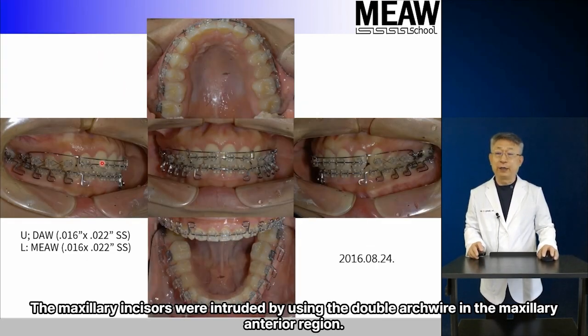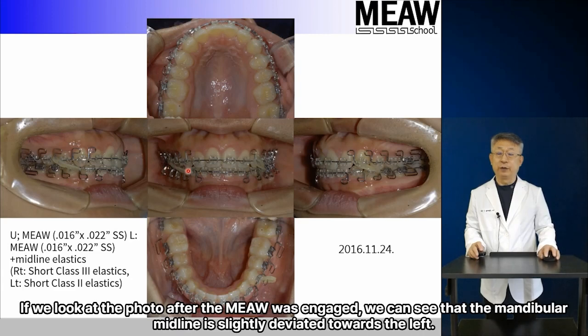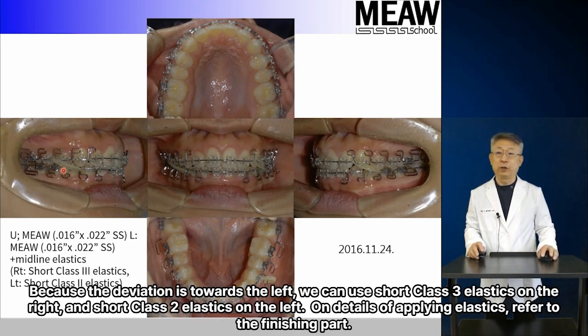The maxillary incisors were intruded by using the double arch wire in the maxillary anterior region. The Mio was engaged afterwards. If we look at the photo after the MEAW was engaged, we can see that the mandibular midline is slightly deviated towards the left. Because the deviation is towards the left, we can use short class 3 elastics on the right and short class 2 elastics on the left. On details of applying elastics, refer to the finishing part.